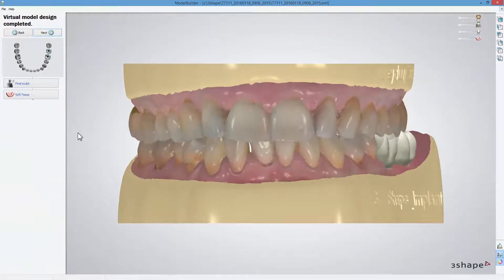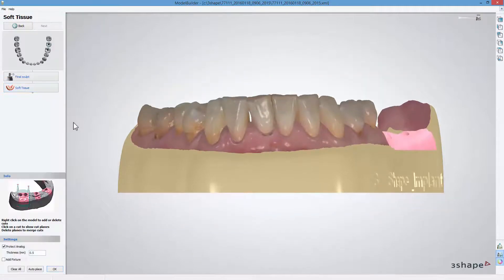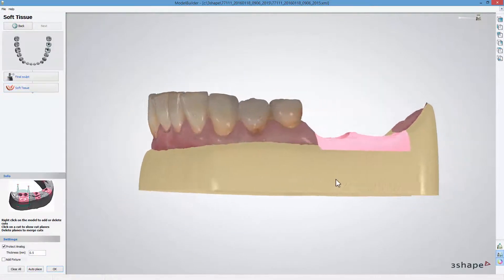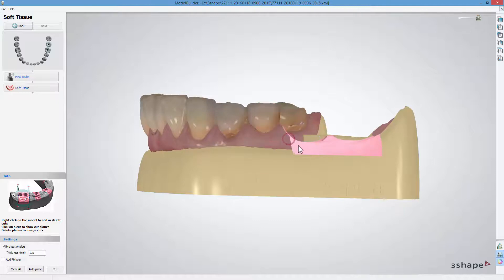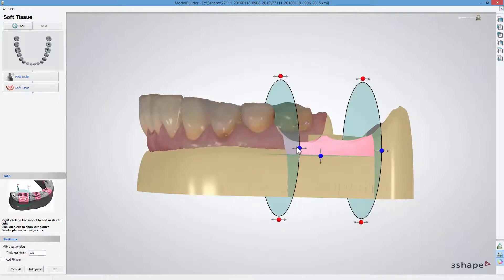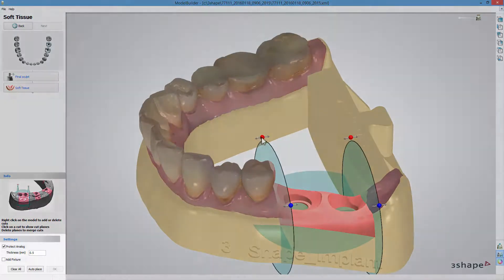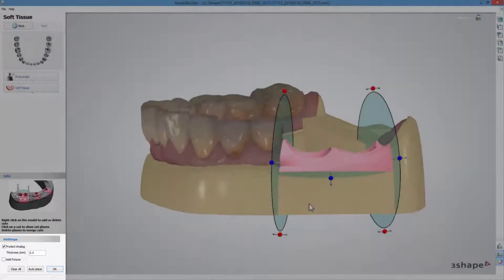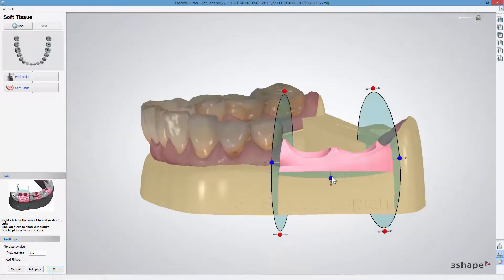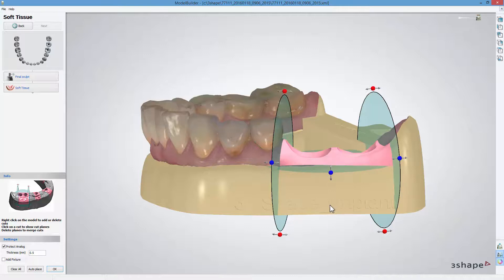This step lets you create a soft tissue cutout. If you wish to add it, press the Soft Tissue button. The soft tissue is automatically placed around the analogue interface. Right-click on the model to add or delete the cut planes. To enable the cut planes, click on a cut. In the settings part, you have the Protect Analogue checkbox. When it's enabled, it allows you to set the thickness value of the surface created around the analogue. Click OK to complete soft tissue modelling.